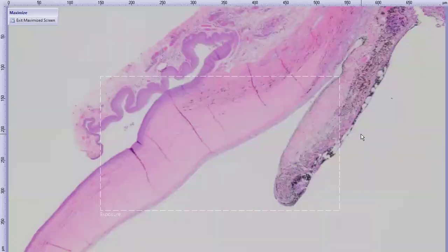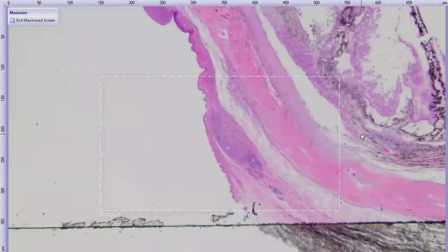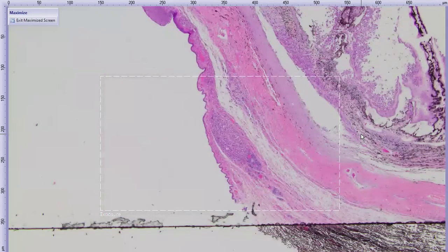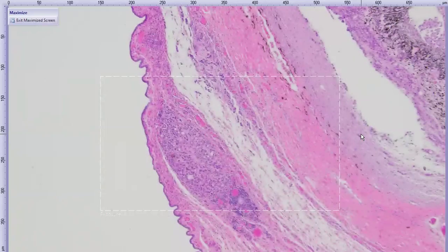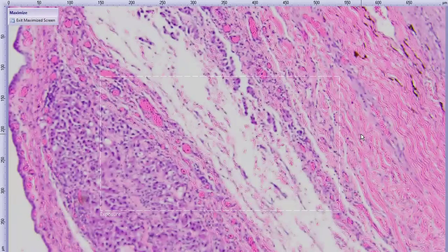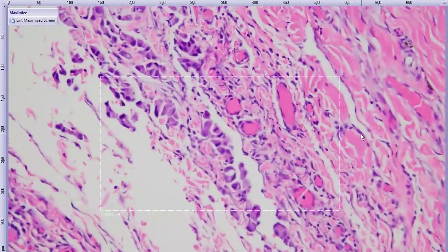The last thing that I'll show you is that way out here, on both sides really, but here in the bulbar conjunctival substantia propria, even outside the eye, or next to the eye, even out here, the same cells infiltrating the tissue.